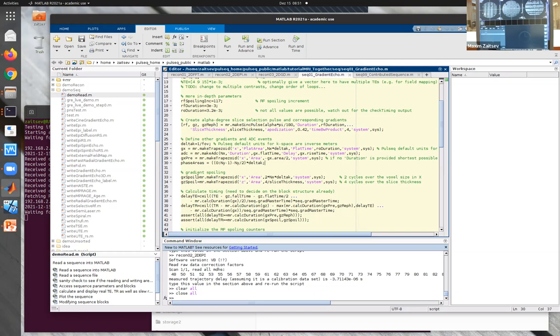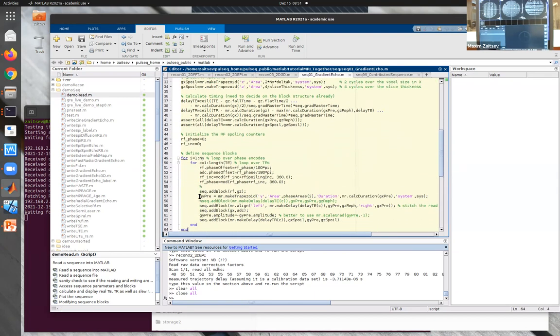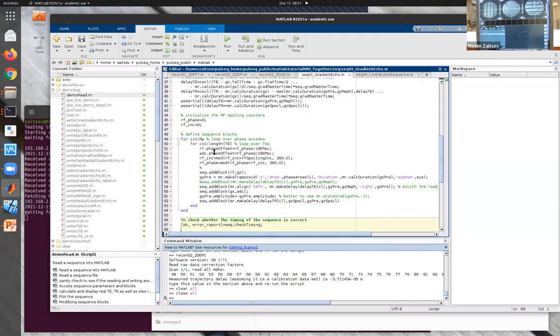So you define your areas, you define your spoilers, you do some calculations for the delays, and then you loop through the time and define your objects block by block. And the important thing is that at this point, you can still be creating objects in the loop if you feel like. It will be lower performance because it will take time. So MATLAB will use time for creating objects, but you can do that. Pulseq will still be able to generate the file.